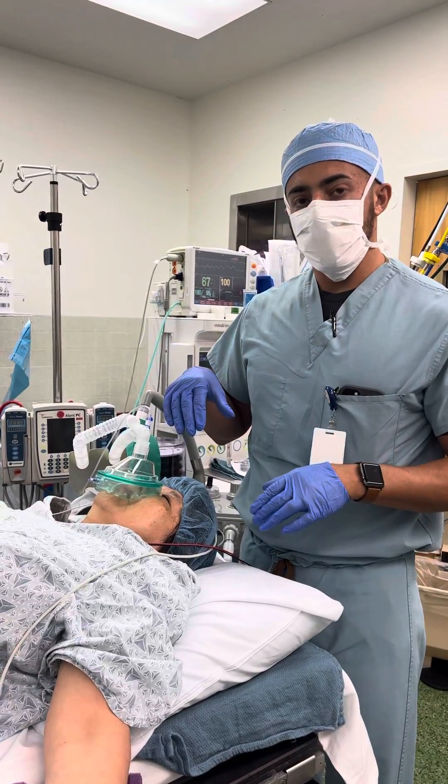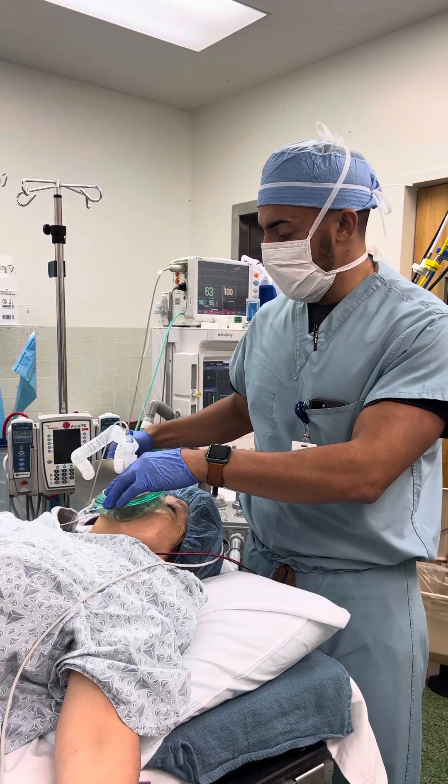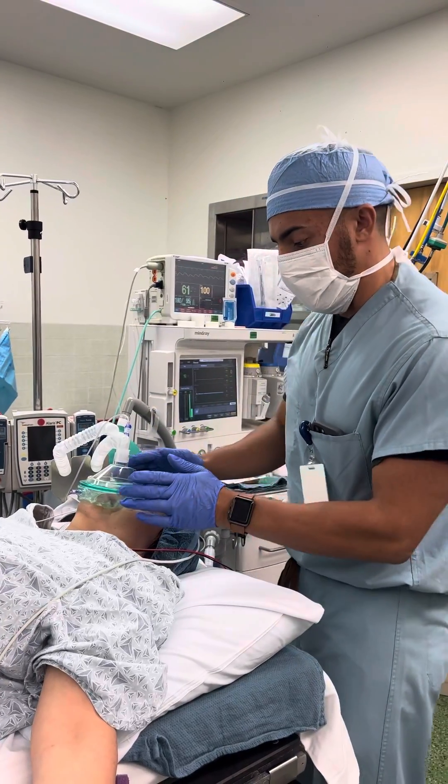Patients getting an LMA for this procedure — I usually use LMA4s exclusively for women, LMA5s for males. So I'll go to the process of induction here.